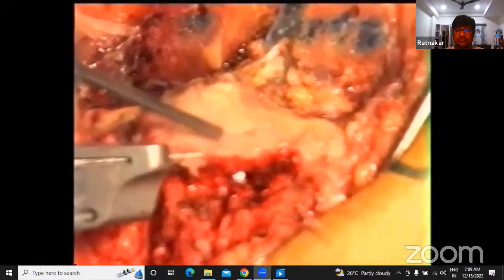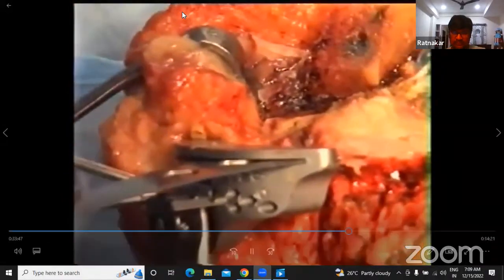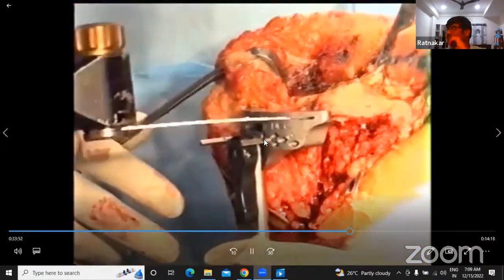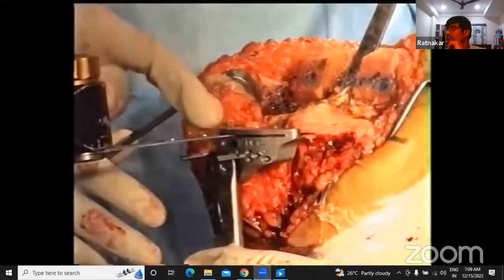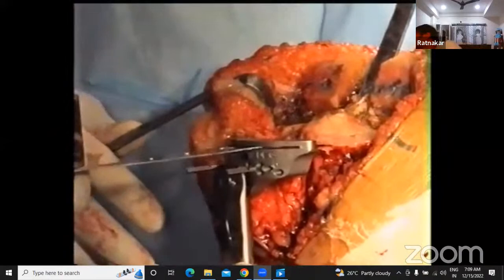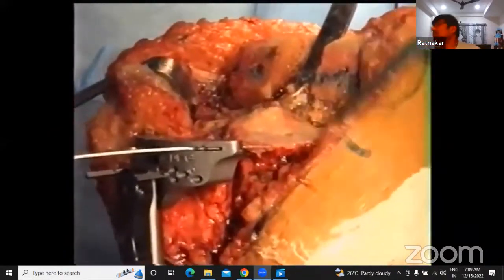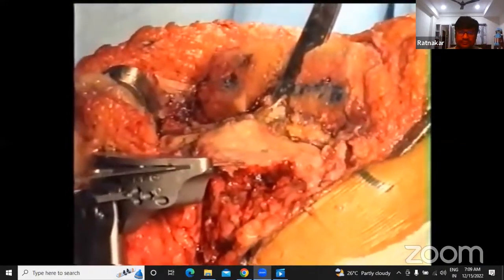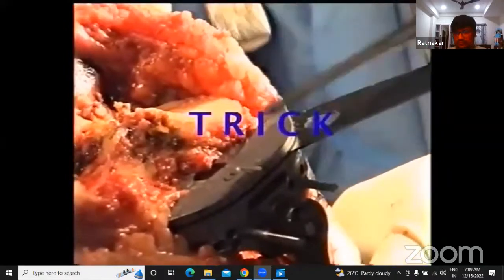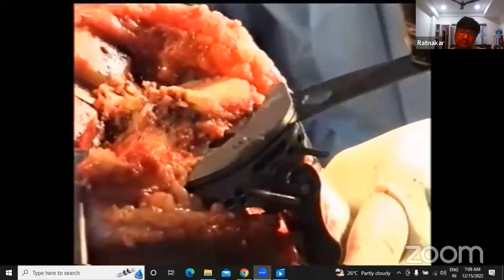Now you can see that is the medial tibial plateau, and that is the lateral tibial plateau, and here is the patellar tendon. So you cannot keep on cutting this way, then you will cut the patellar tendon. So one way out is go for the tibial plateau first and turn your saw this way, come from medial to lateral side, then you can avoid the patellar tendon. That is the patellar tendon.